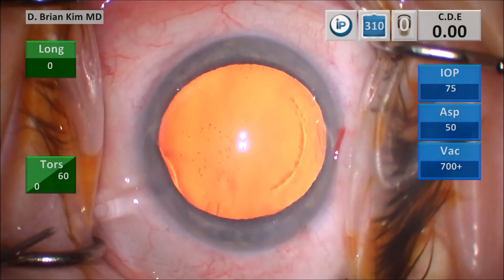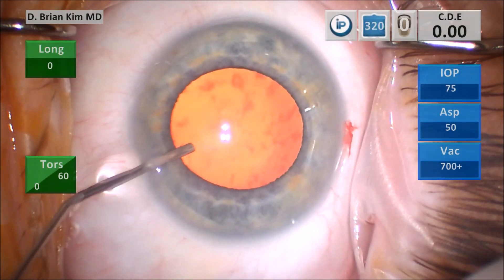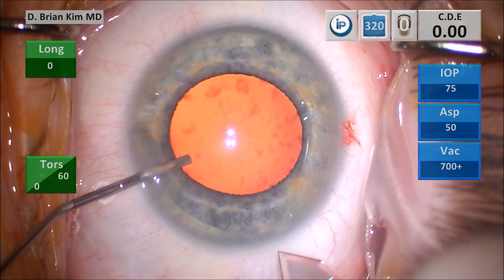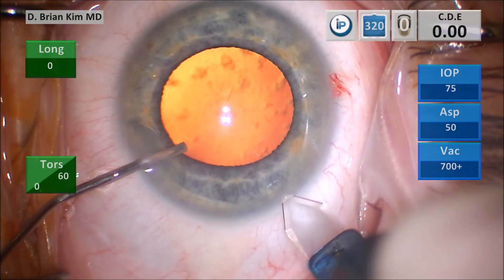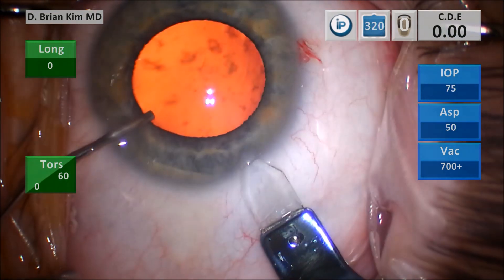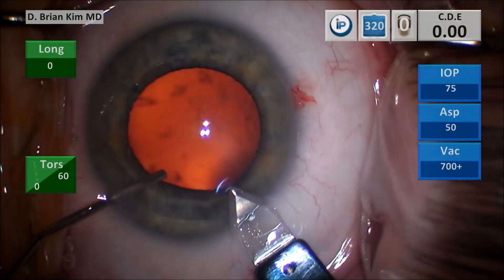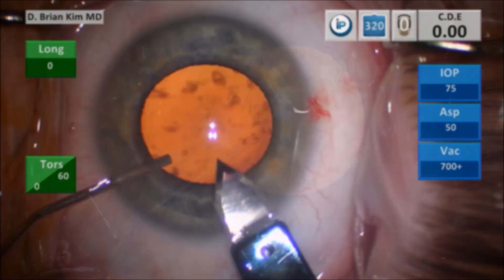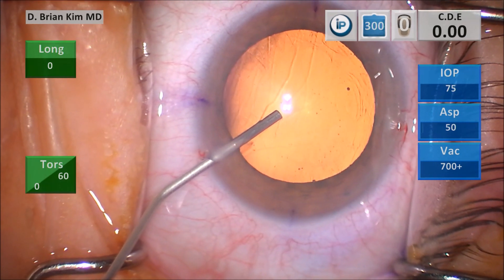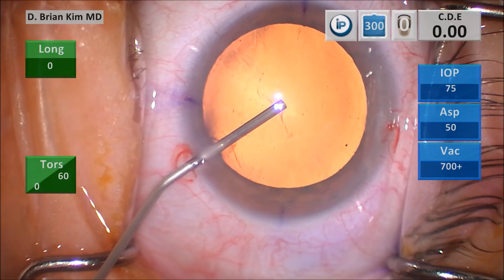I'm going to show you more examples of this. Again, using the cannula to fill the eye with viscoelastic, holding and stabilizing the eye with the cannula, making my vertical groove about one-third depth, finding the deepest part of the incision, tunneling with the blade, then repositioning and puncturing through. That's the triplanar technique. I like to hold the cannula so it's not too deep into the eye, because if the patient suddenly moves I won't accidentally puncture something.